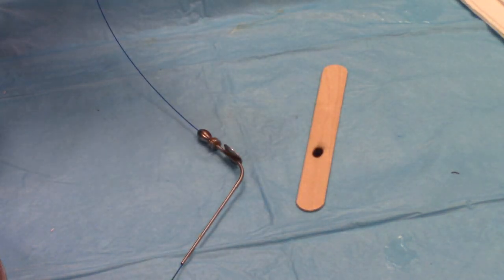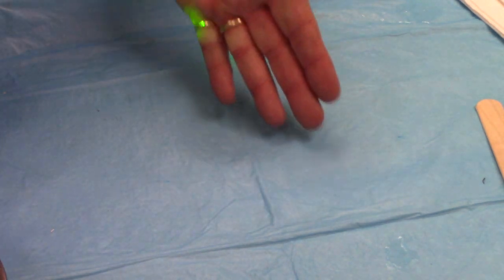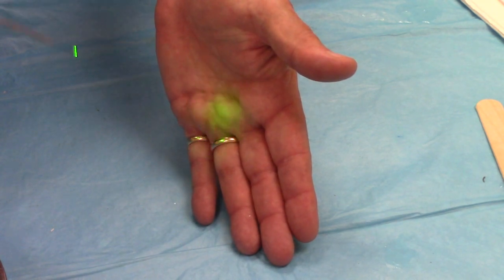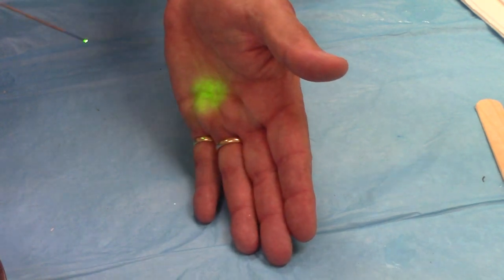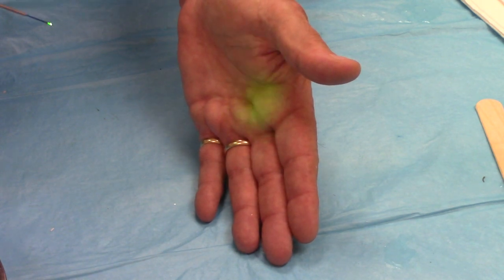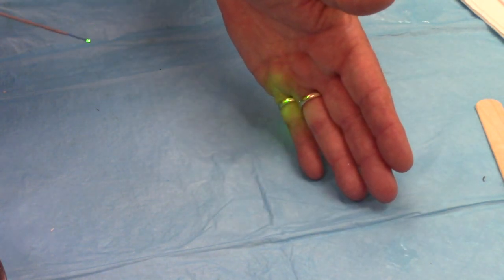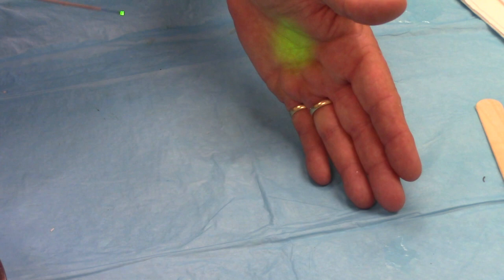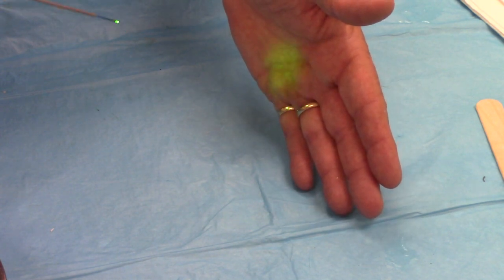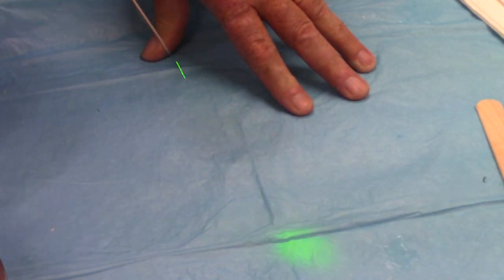Now let's do the same thing with my hand. I'm not even going to break on the video — it's still at the same setting. Let me get my hand in the video so you can see it. It's firing now. Oh yeah, I feel a little bit of warmth, like a sun lamp. Now if I go closer — yeah, now it's starting to get a little warm. We'll stop. How far away was I? About five inches. So it doesn't take much to be safe.